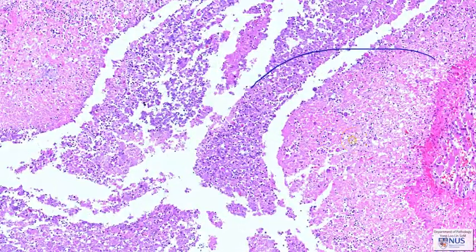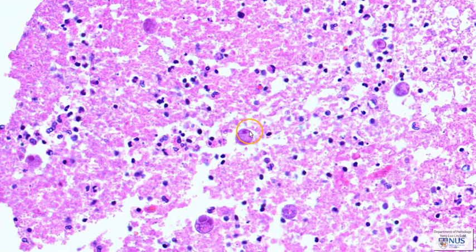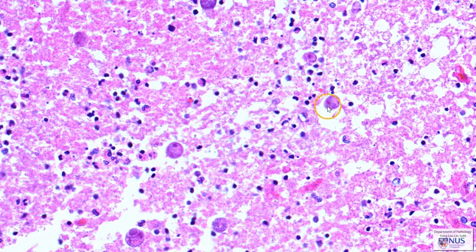And in some areas, we can still make out viable amoebic organisms, which are oval organisms with eccentric nuclei, and some of them have ingested red blood cells. These can be highlighted with the PAS stain.